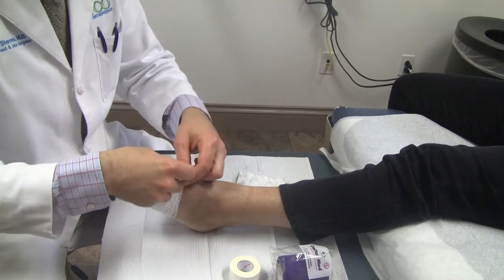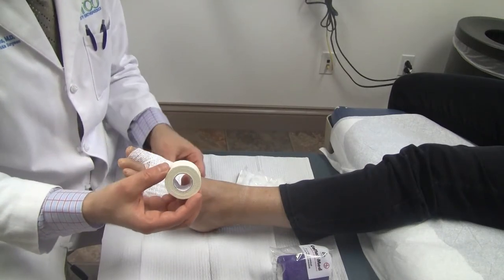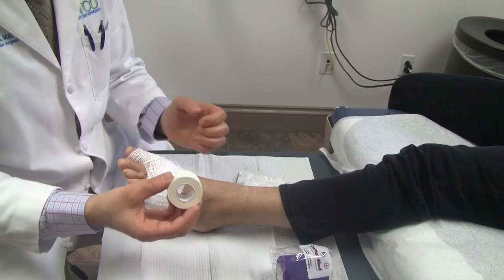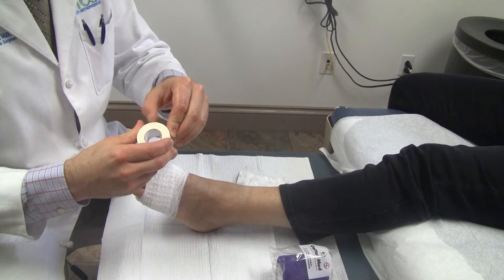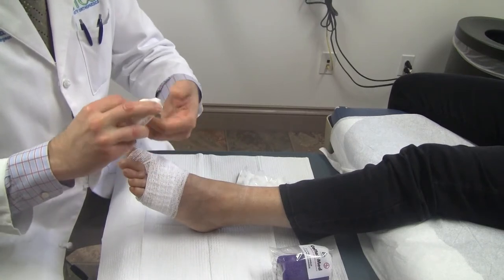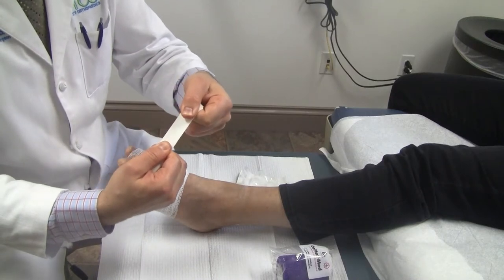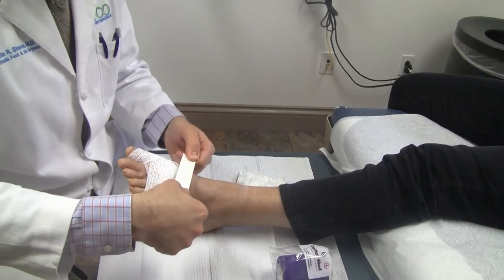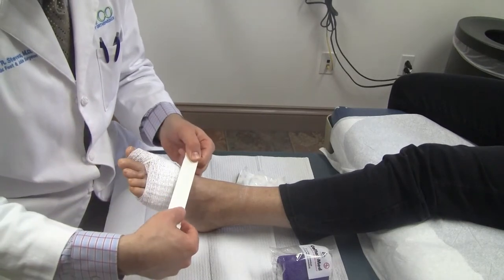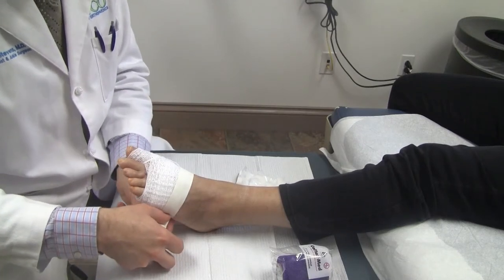Next, we're going to use some one-inch athletic tape by Johnson & Johnson. There isn't anything fancy about this — it's the same kind of tape that an athletic trainer would use to tape a football player's ankle before a game. The qualities we appreciate are that it's cloth, it's very strong, and it doesn't stretch — it's not elastic. So it actually makes a small cast for the toe. I usually overlap the skin on top of the gauze about half an inch or so to keep the dressing from sliding down.